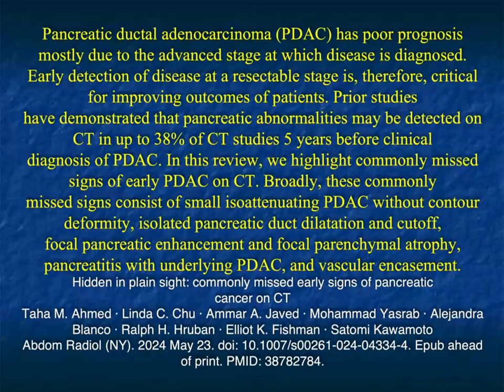And most people don't have AI or even thinking about AI. In this article by Satomi Kawamoto and Taha Ahmed and our group, it was a great title, Hidden in Plain Sight, Commonly Missed Early Signs of Pancreatic Cancer on CT. So we're going to look at what is it you can do now.